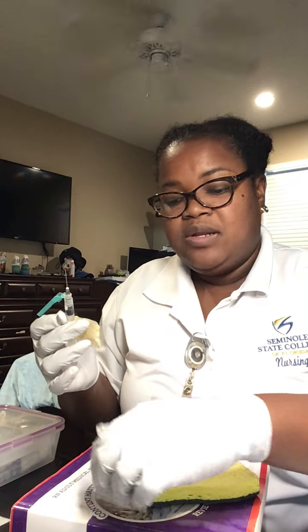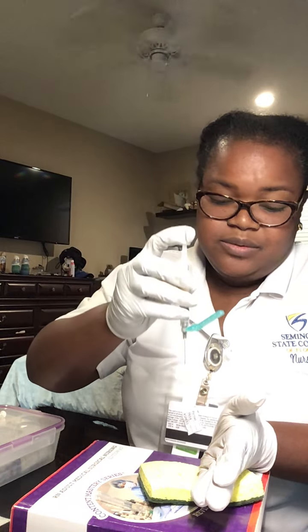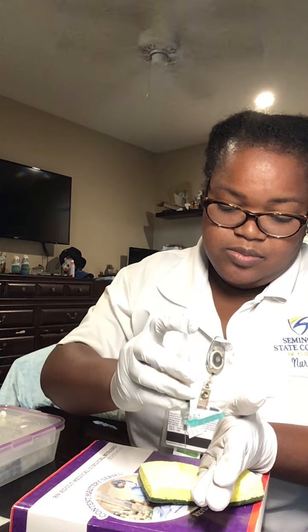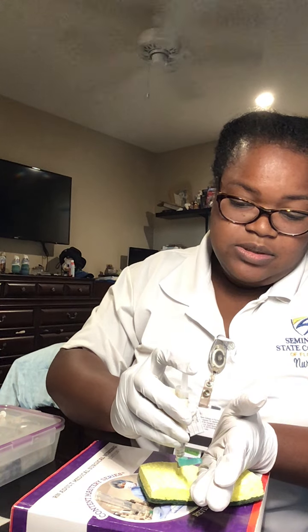Open it. Okay, with my non-dominant hand I'm going to do the Z-track motion at 90 degrees. I'm going to inject. Okay, slowly.